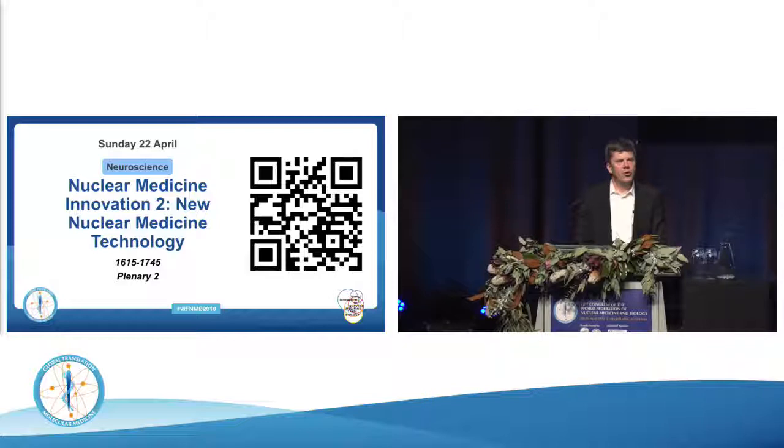And I think the interesting thing there is that there are ways, and time of flight is perhaps the best example, there are ways to get ground truth data, which is such an important part of these applications, and actually measure ground truth data. And that's, I think, the reason it was so successful in this particular example, because you have really good training data sets and lots of it. And I think it can make a difference, yes. And it's essentially for free. You would have to do quite a lot to improve your timing resolution by 40 picoseconds or so at that level, and here you get it just by an algorithmic trick, essentially.